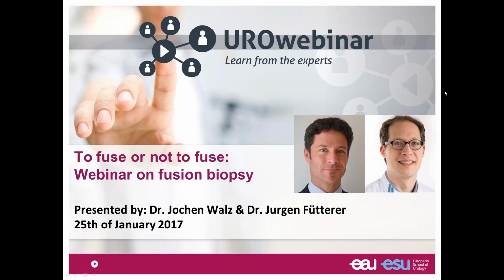But in all the other centers, the highest detection rate and the highest diagnostic reliability you will get if you combine both together. You do your targeted biopsy together with the randomized biopsy, and this gives you a maximum of certainty that this patient had a good evaluation and that this patient has prostate cancer or not. And if this approach then is negative, I think you're quite comfortable that this patient does not need, for the time being, more sophisticated follow-up than maybe PSA and then a re-evaluation a few years afterwards, depending very much, of course, on how the PSA develops afterwards.